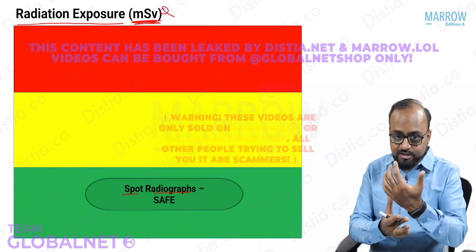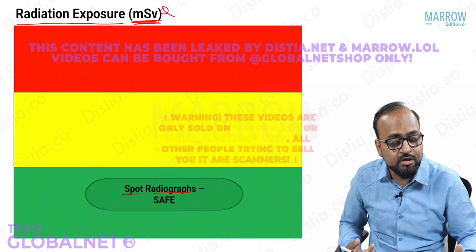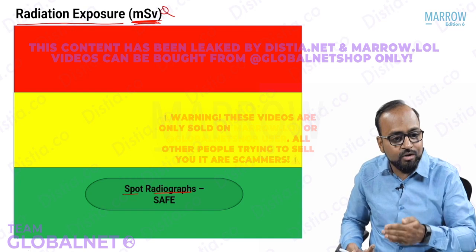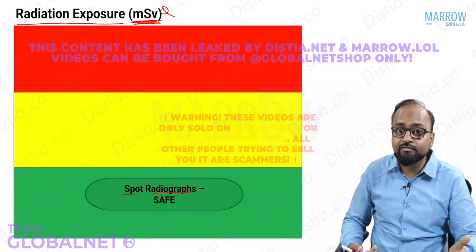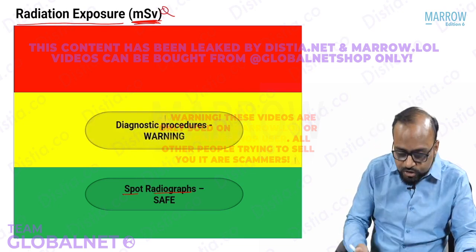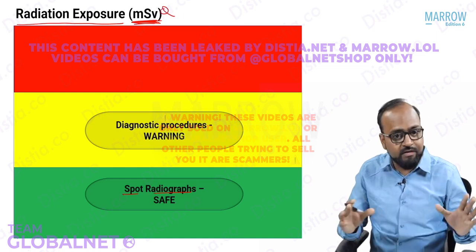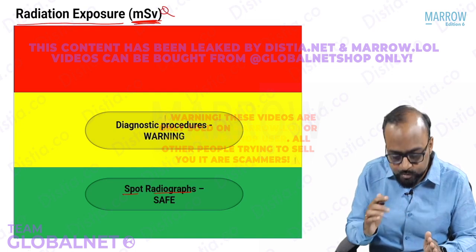But when I do a wrist AP and wrist lateral, how many times is the patient exposed to X-rays? 2 times. So if the patient is exposed once or twice, they are called spot radiographs. Now in certain techniques like IVU, intravenous urography, the patient is exposed multiple times, right? These are called diagnostic procedures. They are yellow zone or warning zone. So spot radiographs are safe because the patient is exposed only once or twice, low radiation exposure, green zone or safe zone.